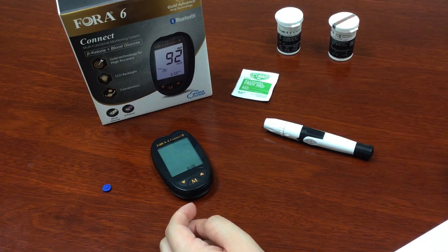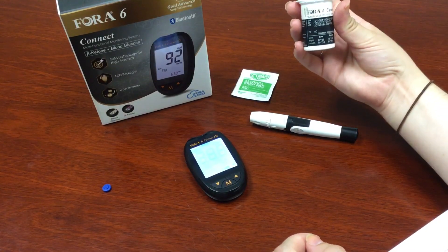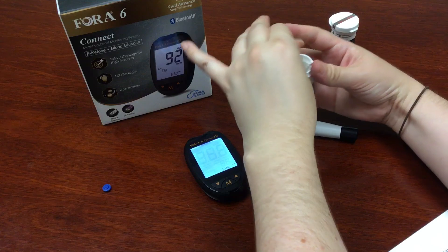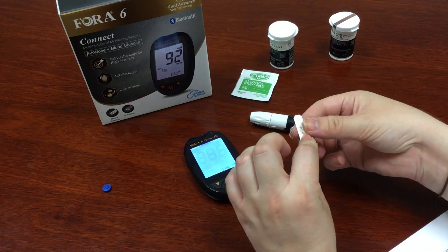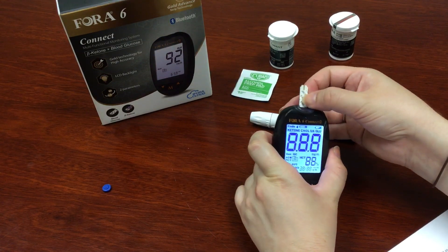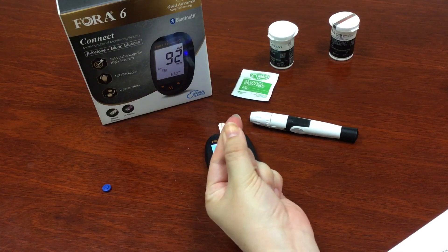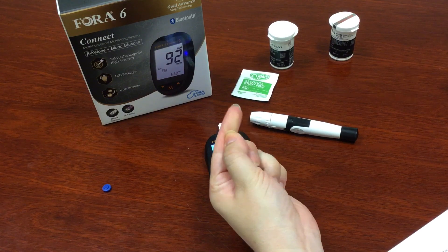So first we're going to measure your glucose levels. Remove the glucose test strip from the bottle and close it up tight so no contaminants get in. This is the front of the test strip — you'll insert it at the top and the meter will turn on automatically. Make sure to rub the side of the puncture to get the blood flowing, so you'll have enough when you do prick yourself.